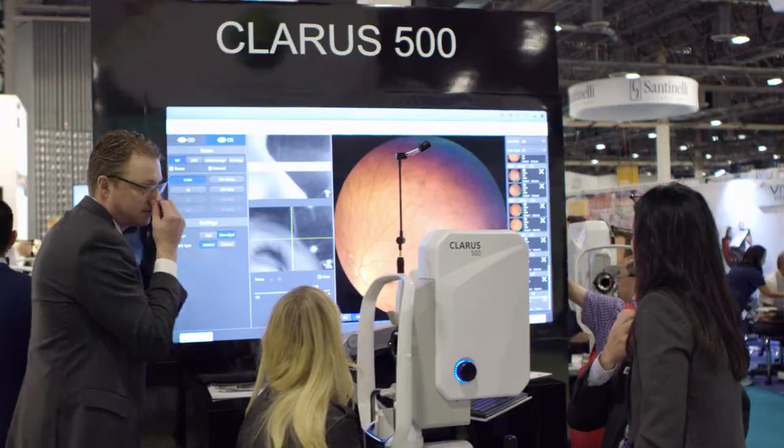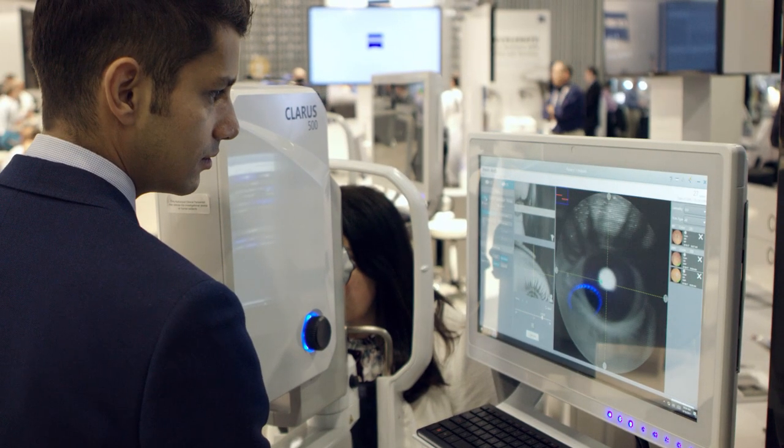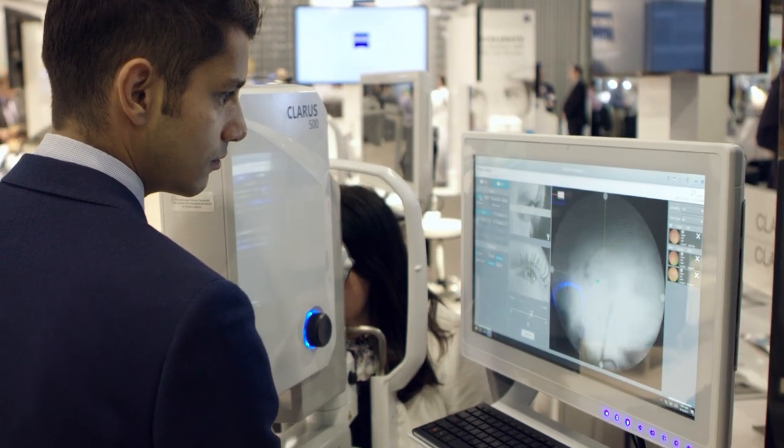A lot of people are using it for two reasons. One, to document pathology like you would with a standard fundus camera. And number two, as a screener before a dilated fundus exam, or sometimes actually in place of a dilated fundus exam. So you can use it for glaucoma, macular degeneration, retinal tears, and any peripheral disease.